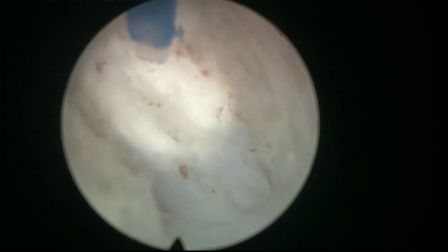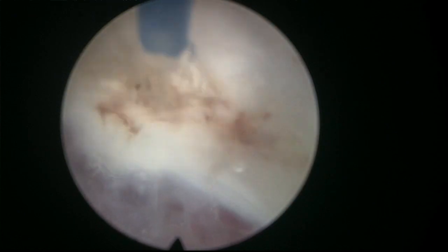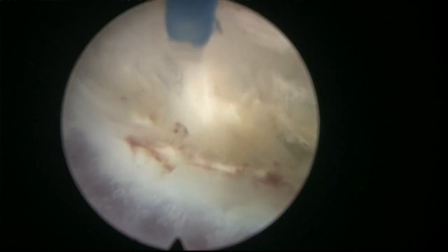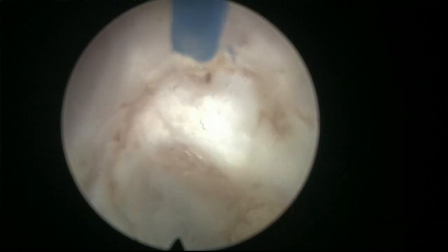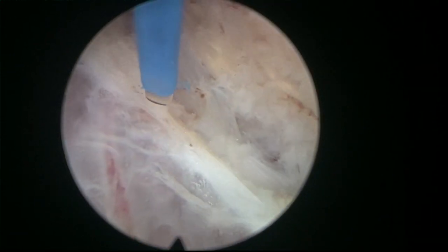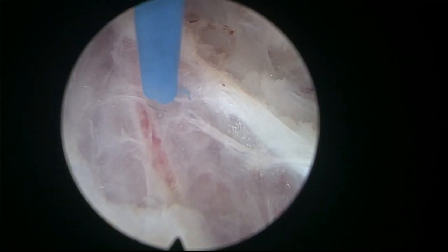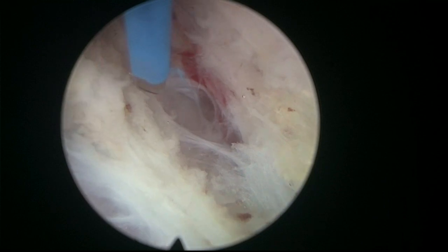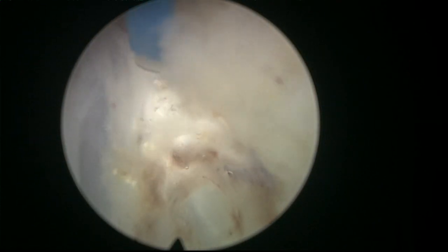Of course, if it looks deep, or if it looks as if you're getting deeper and deeper, you can correct, you see, by getting closer to the adenoma. And here is where we changed. We were following this plane, it looked a little bit deep. So I changed the direction of the fiber to correct the plane again.